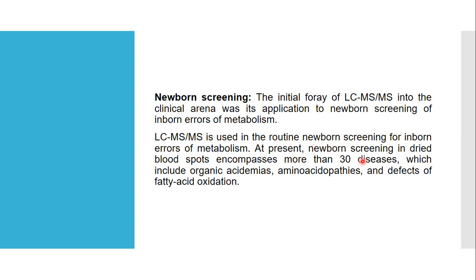At present, newborn screening in dried blood spot encompasses more than 30 diseases. That is, by analyzing the dried blood spots of the newborn, we can analyze 30 diseases, which include organic acidemias, then amino acidopathies, then defect of fatty acid oxidation. Now, this defect, fatty acid oxidation, it is related to sudden infant death syndrome. Okay, so all these diseases, they can be found out by analyzing the blood spots, which is possible with help of LC-MS.